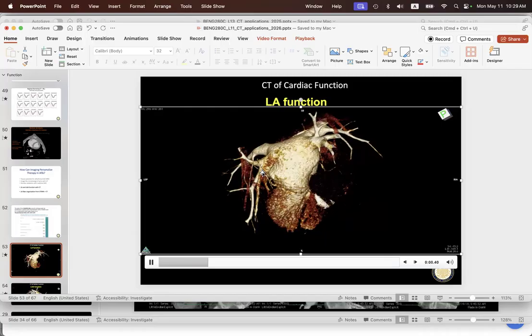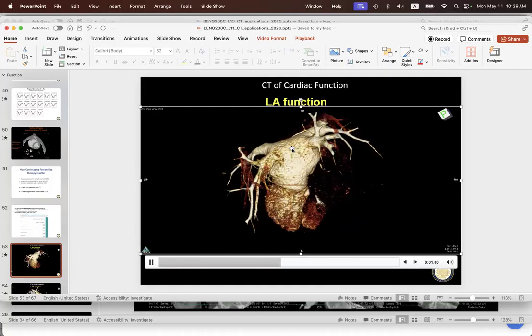This is an interesting signal, right? This is where the contrast is running out. So basically, the contrast has dropped to a point where this is just kind of blood, fresh blood, and you can actually see that flow. Nobody uses this to measure flow, but obviously you can see the flow there. But we see a couple of things. We see early atrial contraction. If you look at the mitral valve plane, it goes up and then down with ventricular contraction.